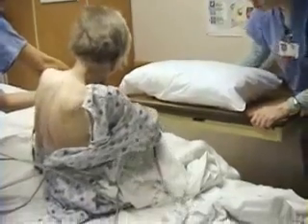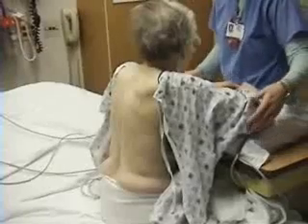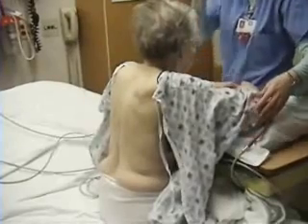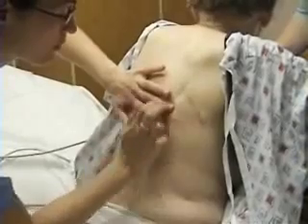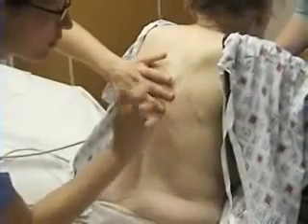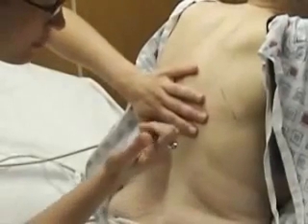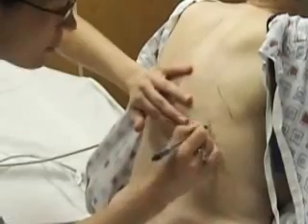You will need an assistant to help position and monitor the patient and assist with the collection of pleural fluid. Place the patient in a sitting position on the edge of the bed with his or her arms resting on a table. The height of the effusion is determined by auscultation and percussion of the posterior chest wall. With a skin marking pen, mark the needle insertion site. The site should be 5 to 10 centimeters lateral to the spine and at least one or two intercostal spaces below the top of the effusion.